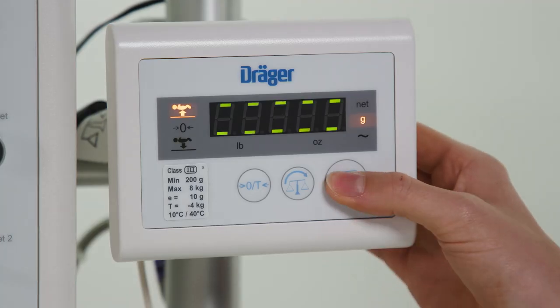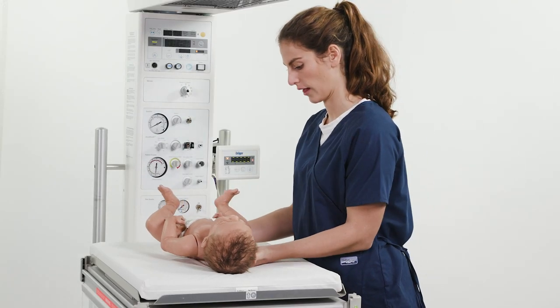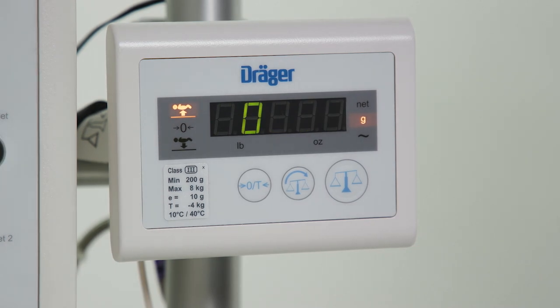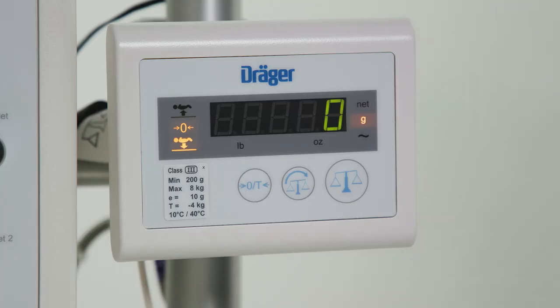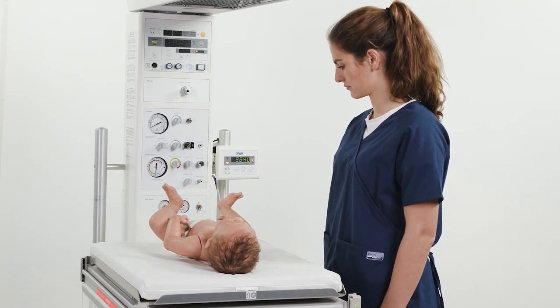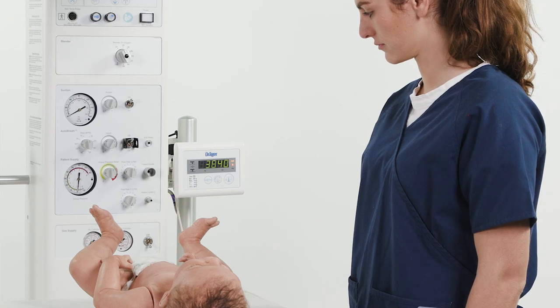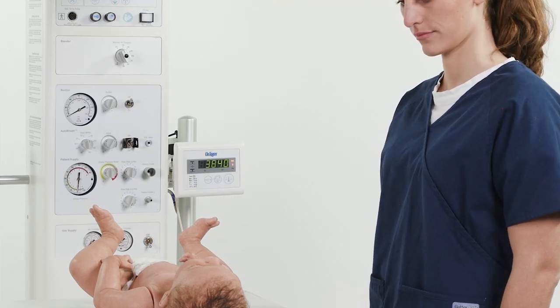Press the weigh button. Ensure the bed is in a level position. The lift patient symbol is illuminated. Lift the patient off the bed. When the lower patient symbol is illuminated, place the patient in the center of the bed. The captured weight of the patient is shown in the window. The net indicator illuminates. The captured weight will be displayed for 6 minutes.